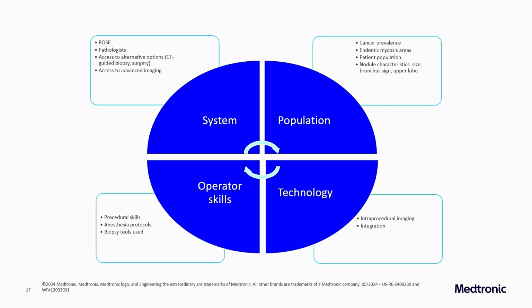And we're trying to infer from all of this what the responsibility of the technology is when we look at diagnostic yield. The diagnostic yield is influenced by all these things. And what we infer from these studies is that the particular robot, the particular platform, is actually responsible for the diagnostic yield. Well, you can't do that, because you need to look at the whole thing. You need to balance both groups for all these confounding variables. You can do that with some adjustment, propensity score matching and whatnot, but you're always going to miss the ones that you don't know about.